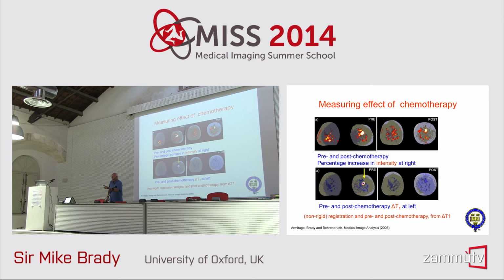That is the enhancing ring of the viable tumor. The blue in the middle is the necrotic center. The cells have already died. Right? It's the same shape as that, but that tells a different story. And 3 months later, that becomes that. What do you, as a clinician, say now?